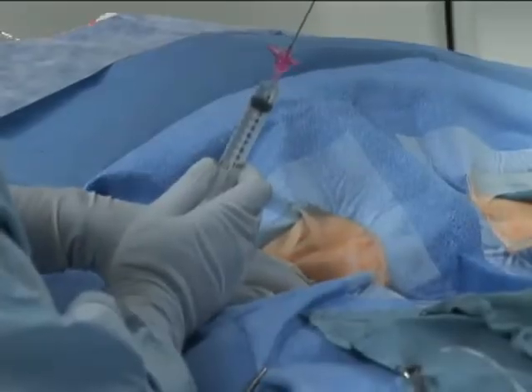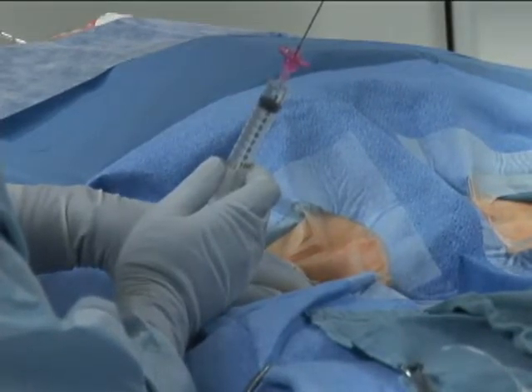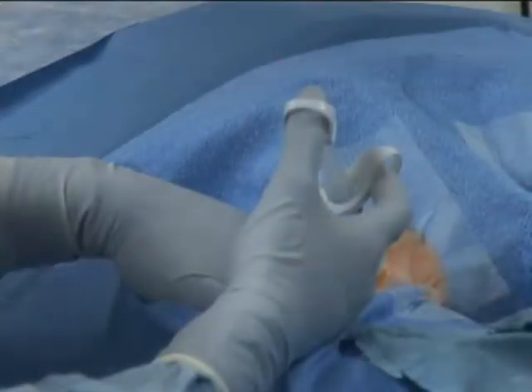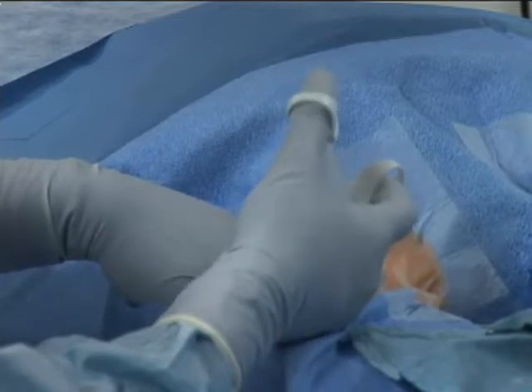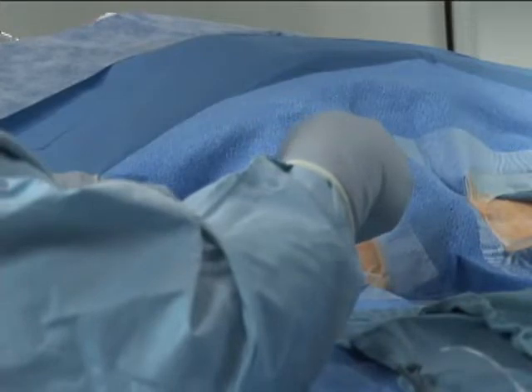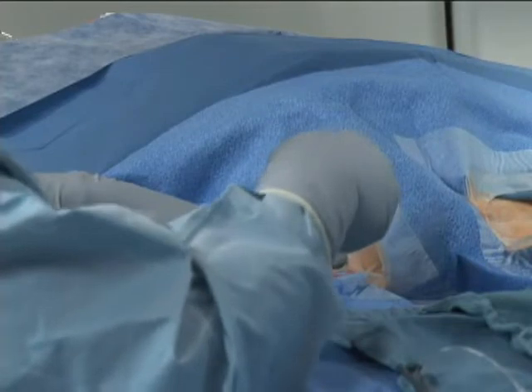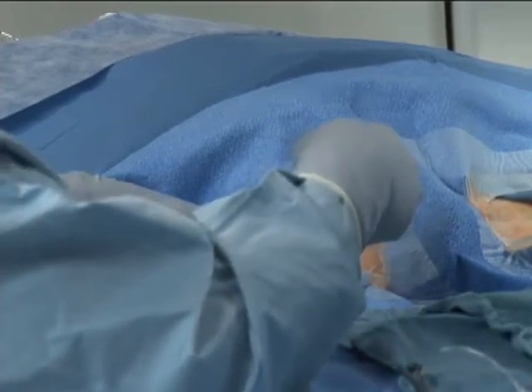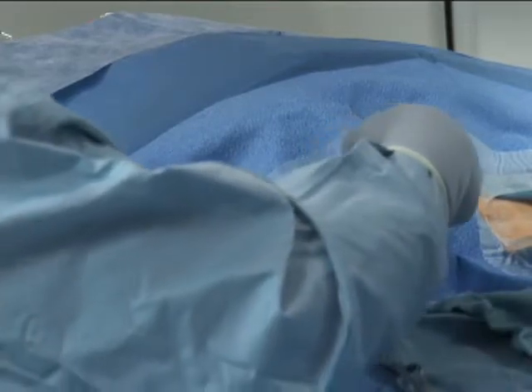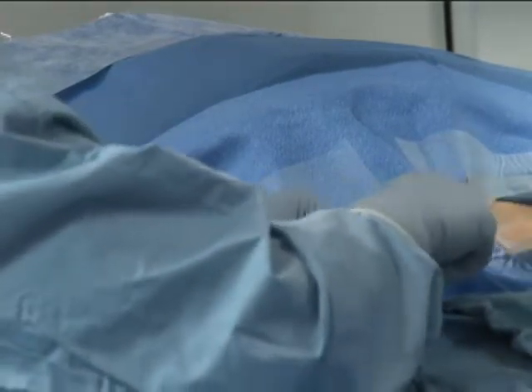To obtain venous access, first feel for the femoral artery, which then identifies the location of the femoral vein about 1 centimeter medial to the artery. Local anesthetic over the femoral vein is given at this point. After adequate local anesthesia has been achieved, the femoral vein is accessed using the modified Seldinger technique. Ultrasound guidance may be desired for venous access because it allows entering only the anterior wall of the vessel, reducing the likelihood of post-procedural hematoma. A wire is placed through the needle once there is blood return.